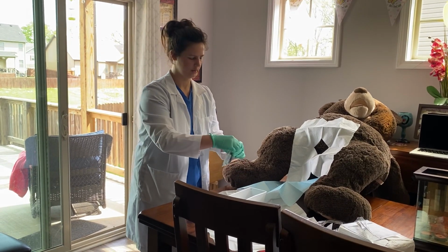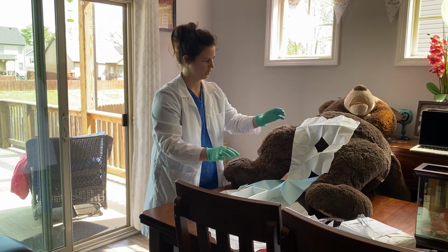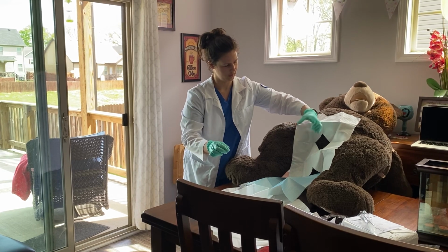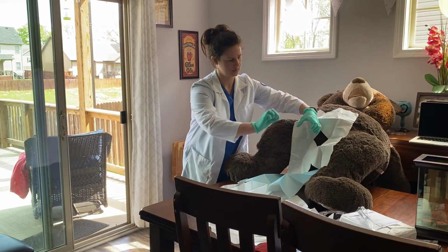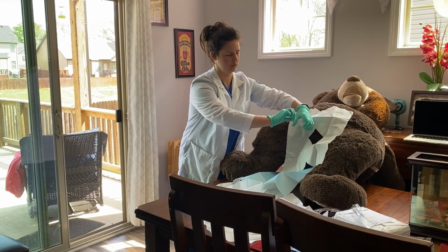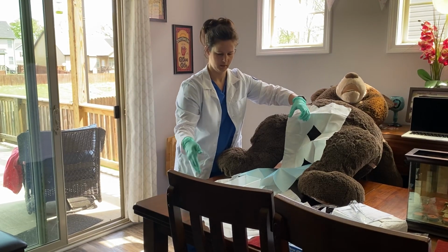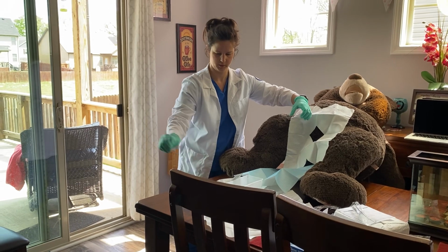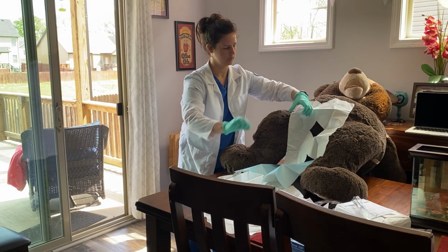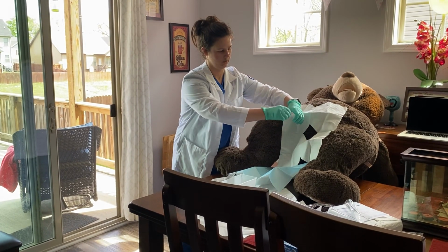And I'm going to pretend that I'm opening this, but you want to open it up and leave it on the side, and you want to take your non-dominant hand and hold the penis straight, and take each swab starting at the tip of the meatus in a circular motion, and you want to go downward and then drop it off to the side. If you have a little trash can or a bag on the side, you don't want to put it in your sterile field, you want to put it in there. And then however many other swabs that you need, start at the ending point and keep going downward in a circular motion, and the last one go all the way down.